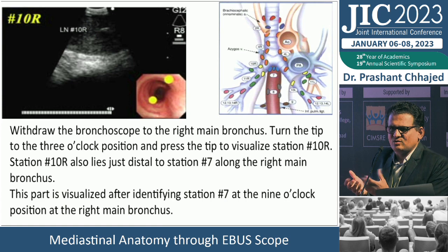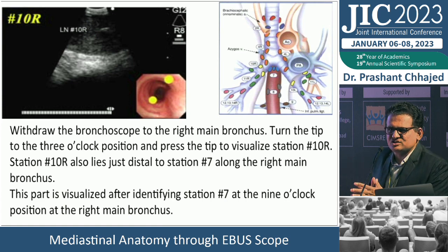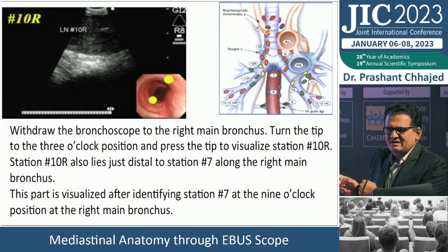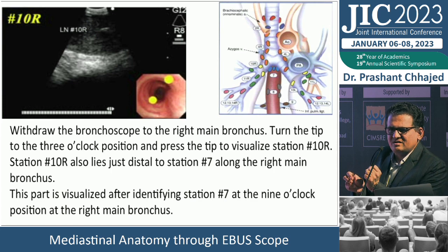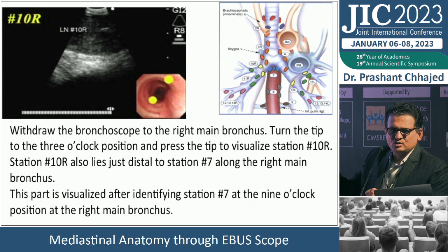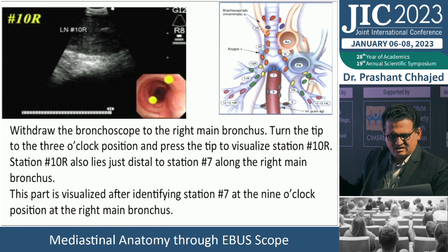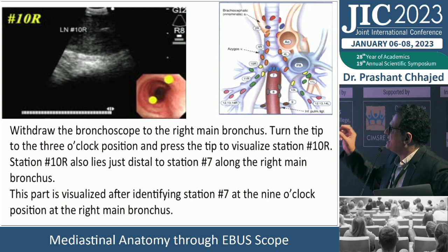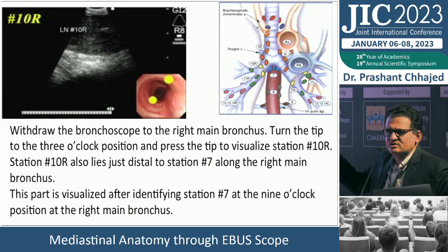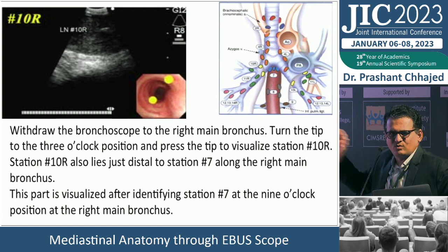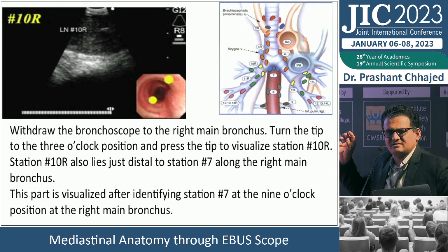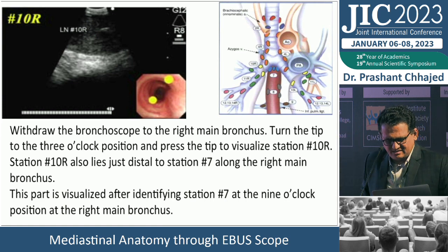Just as with conventional TBNA, go into the right main bronchus, advance toward the right upper lobe, turn the scope to puncture station 7, and station 10R is found just opposite station 7. These are the starting positions, but subtle wrist movements are needed to actually locate lymph nodes since their enlargement won't follow textbook positions exactly. These are the methods to systematically identify these lymph node stations.